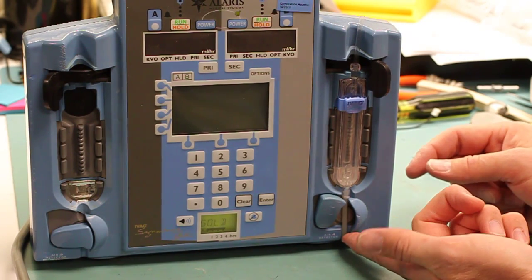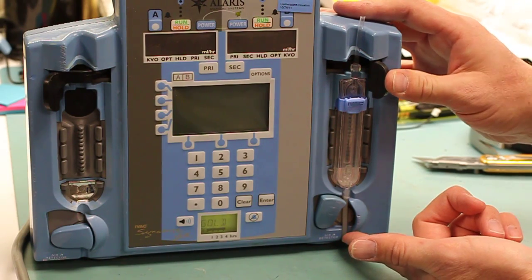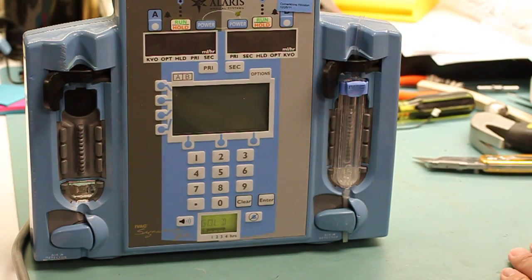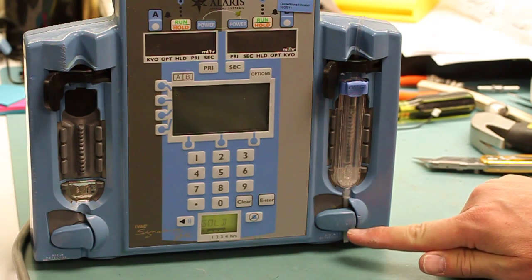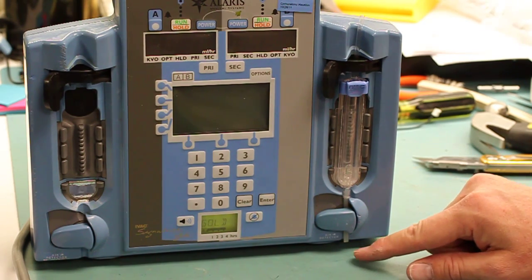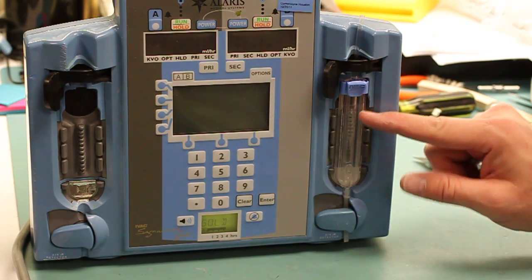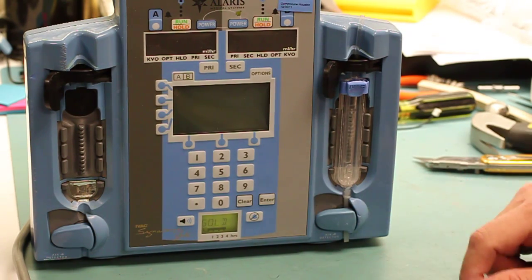Once that has been done and the cassette has been properly inserted, all you need to do is close the latch properly, seeing that the AIL transmitter is now over the IV tubing. The purpose of the AIL transmitter is to prevent any air-in-line in the IV tubing from being sent to a patient.